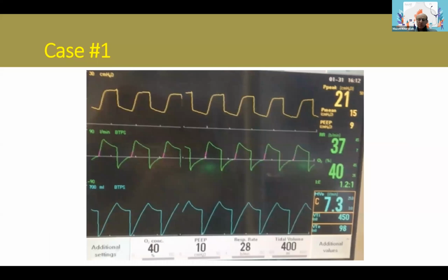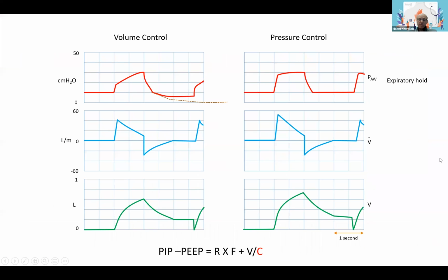Okay. So I'm not sure if you see the equation of motion at the bottom, right? This is the one here. So you can see the equation of motion here. And this is actually very important, you really need to understand the equation of motion. And that's why I started those ventilator rounds by talking extensively and deeply about the equation of motion. So the equation of motion is the difference in the pressure on the left side should equal resistance multiplied by flow plus volume divided by compliance.